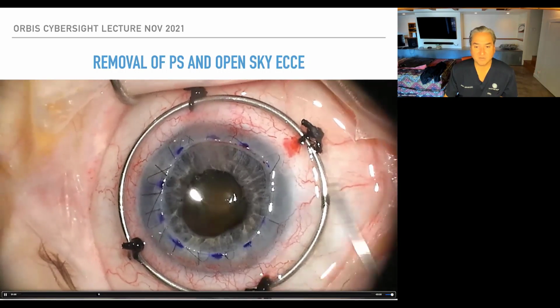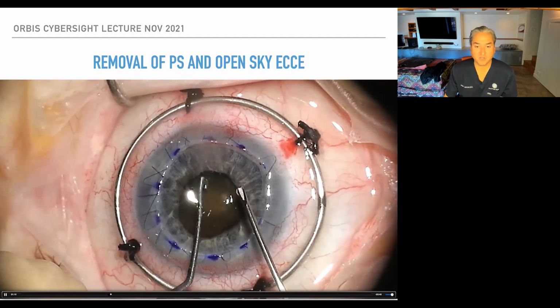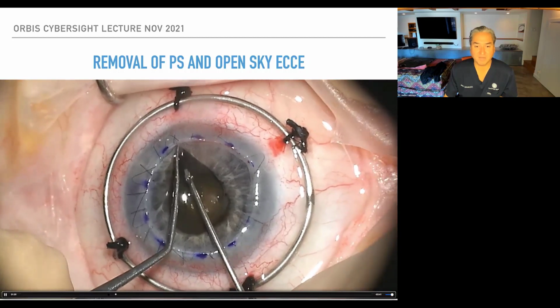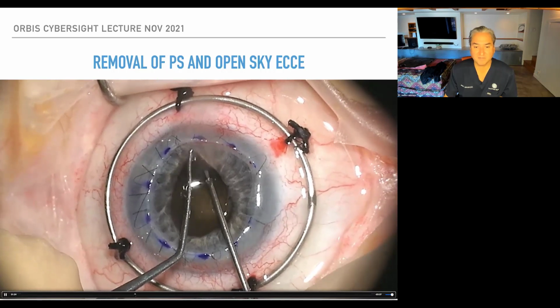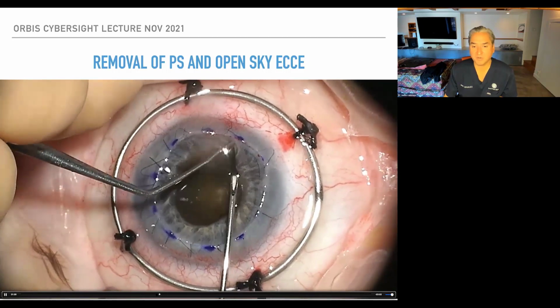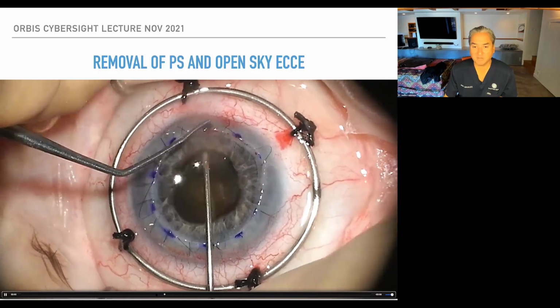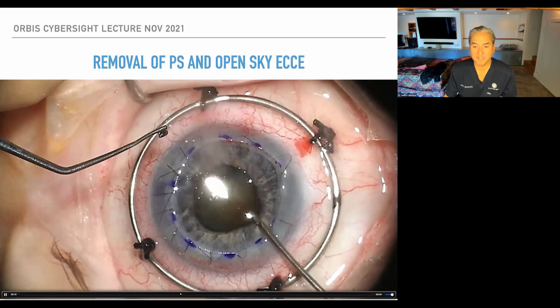I'm using the cystotome, and I'm just going under there, and I'm going to try to retract the iris here so that I can do a can opener style capsulotomy that doesn't leave a tiny little capsulotomy. So I'm just going to go around and do this. Continue. Using the push-pull to move the iris out of the way. And you can see I'm just scratching it and bringing them to the middle there. And then same thing in this lower quadrant.